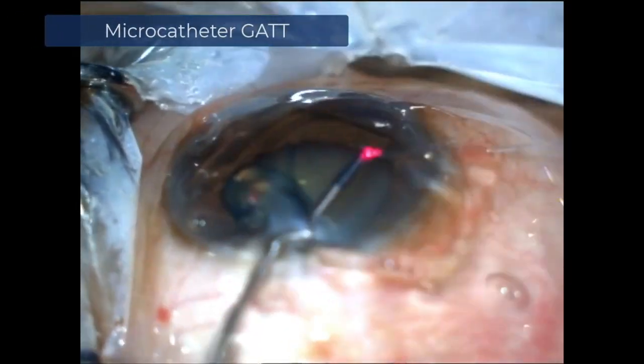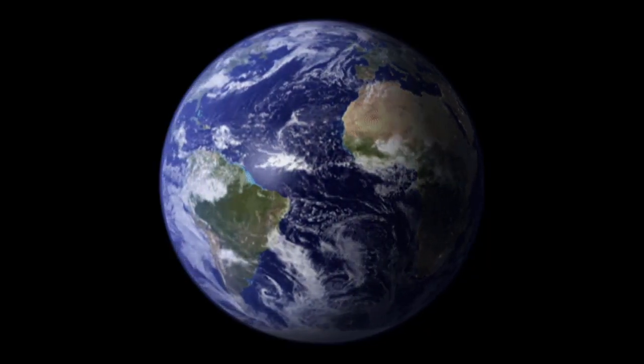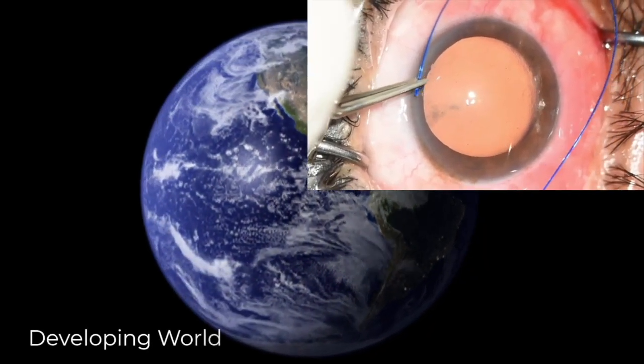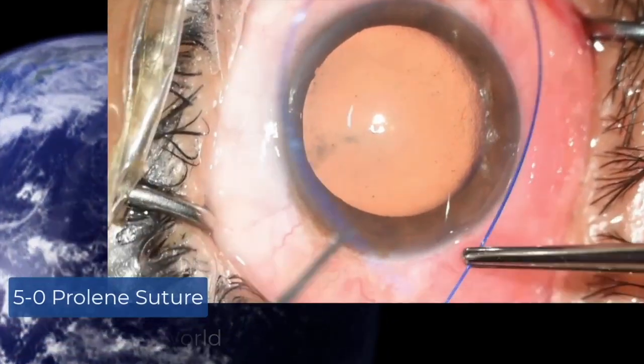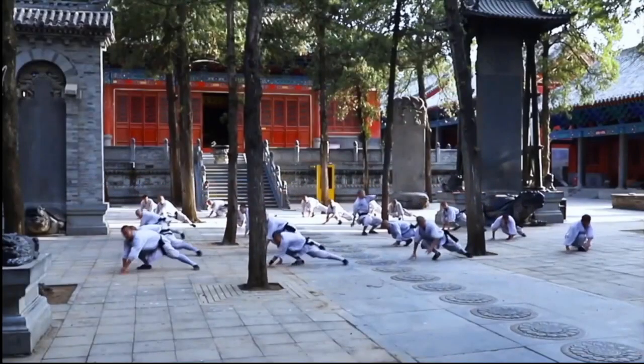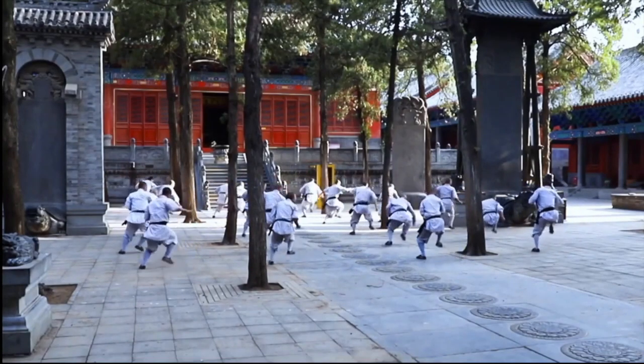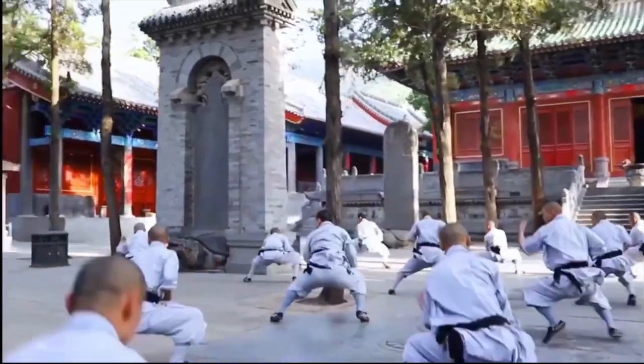This procedure is conventionally done with an expensive illuminated microcatheter. Alternatively, in the developing world, one can do this procedure using a low-cost 5-0 Prolene suture. Like learning any other new procedure, learning suture GATT is also a challenge and requires practice and perseverance to master it. It is like learning martial arts in a Shaolin temple.